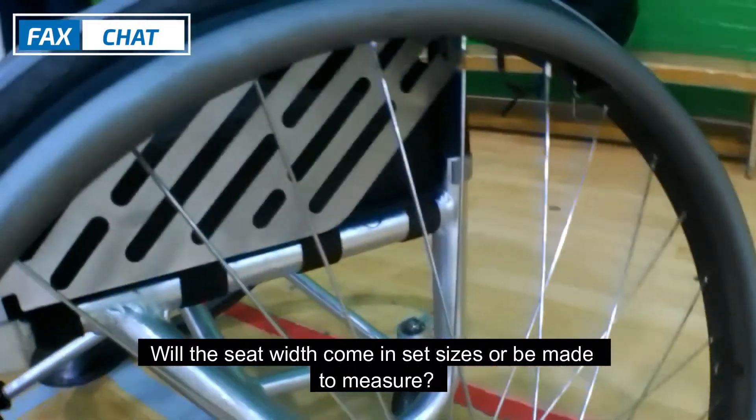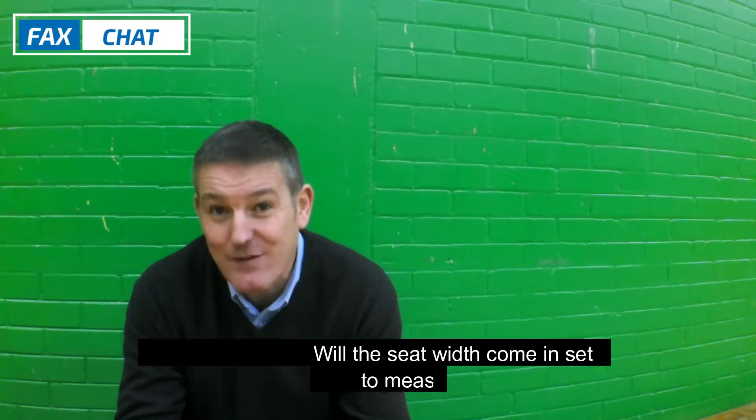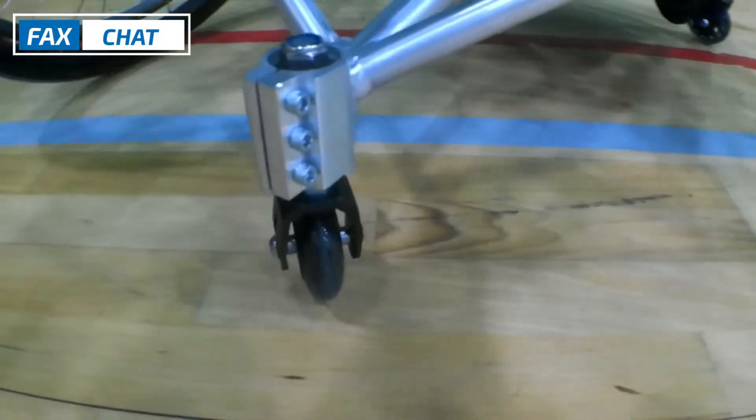One thing that we see is not adjustable in the chair is the actual width. Is there going to be set sizes, or can people get specific width sizes they want? Yeah, good question. We're looking at doing a couple of sizes — a 400 millimetre seat width and a 440 — which will give scope for different players. Some of the players who are narrow-hipped can get some foam padding either side. But we're aiming for this to be a generic standard club chair. We do high-performance, made-to-measure chairs as well if people need that.